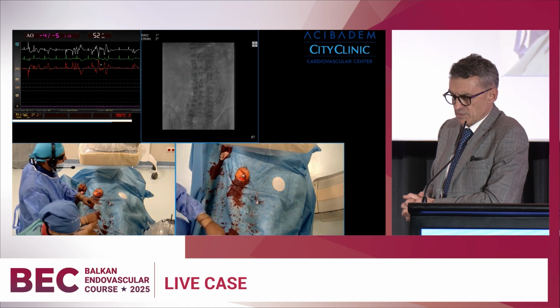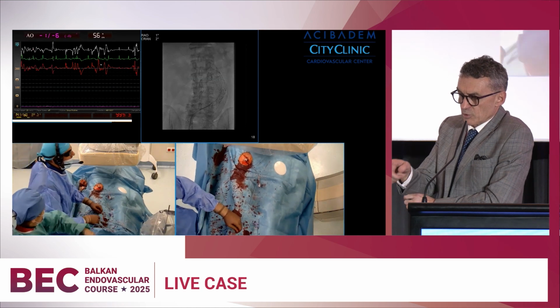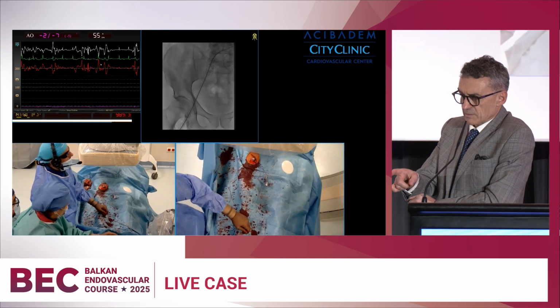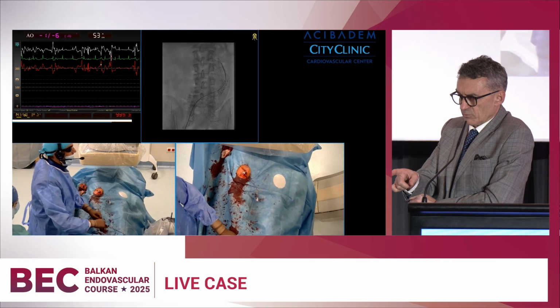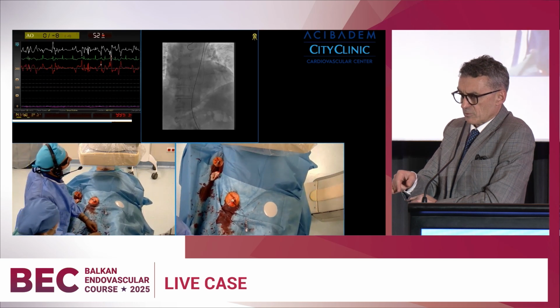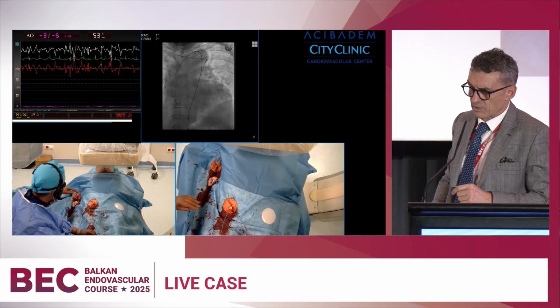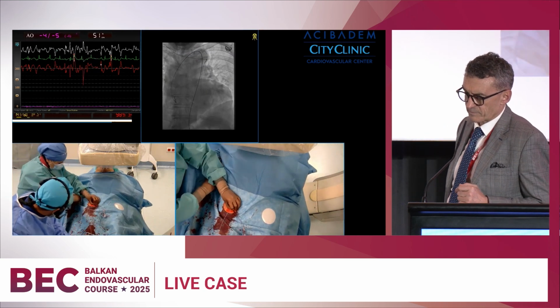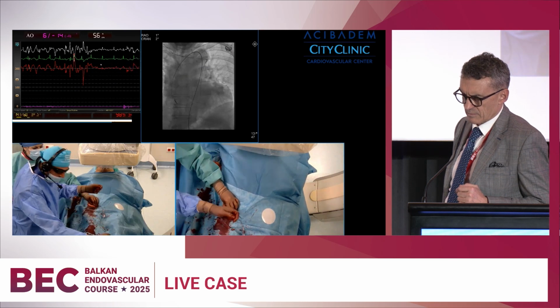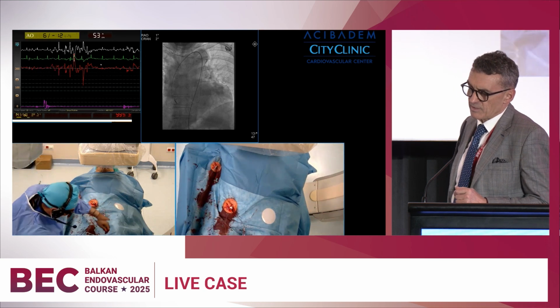Is this the Lunderquist? Yes. You are going to see now how the Lunderquist will straighten the anatomy. Follow, go up. Excellent, that's enough. Across the aortic arch. And now we put a pigtail catheter from the brachial approach for the angio, only for angio.